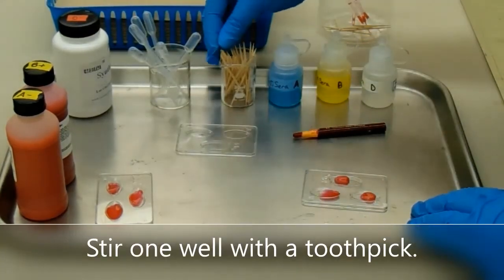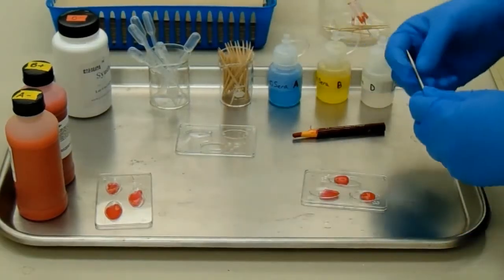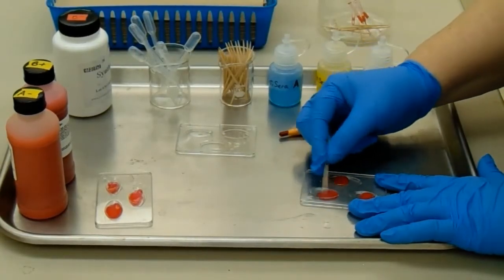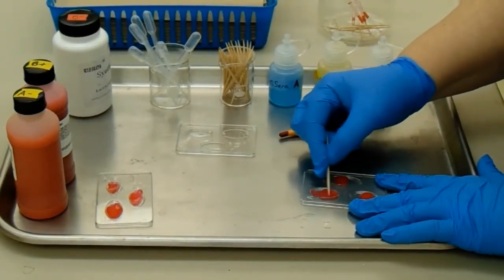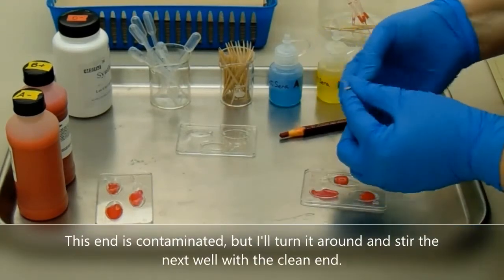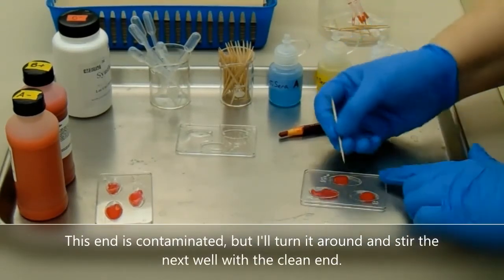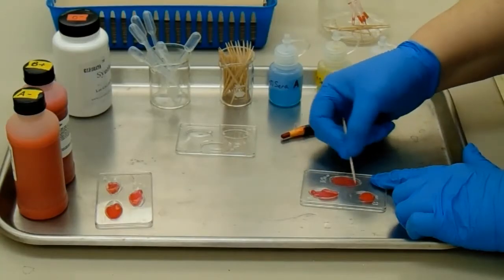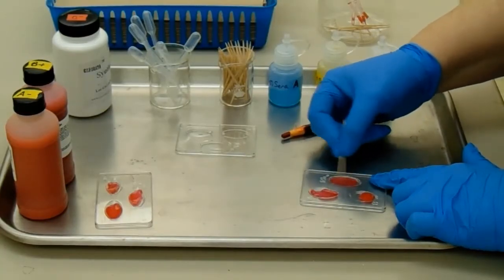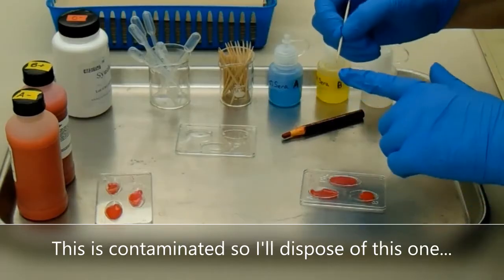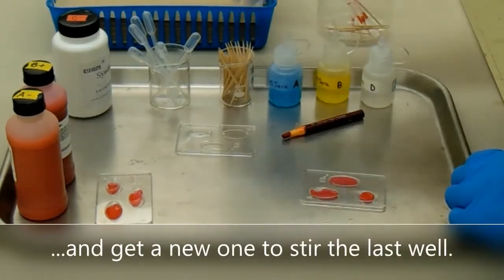Stir one well with a toothpick. This end is contaminated, but I'll turn it around and stir the next well with the clean end. This is contaminated, so I'll dispose of this one and get a new one to stir the last well.